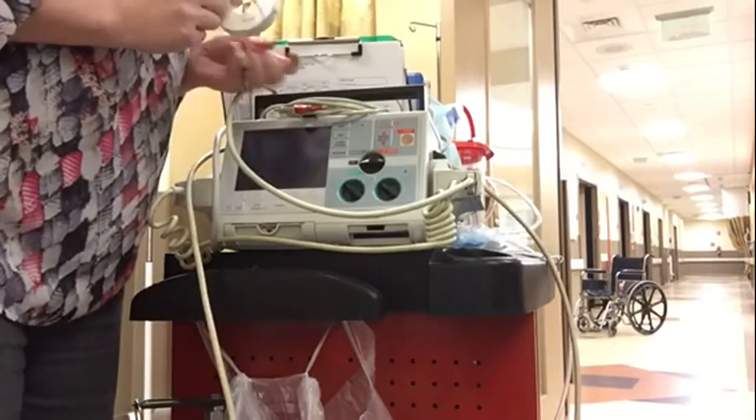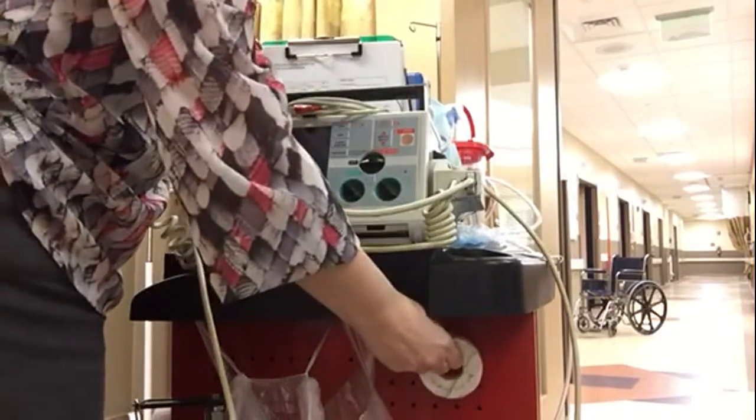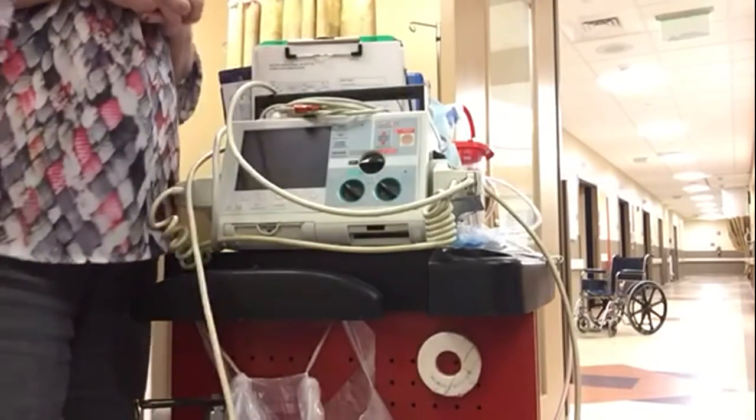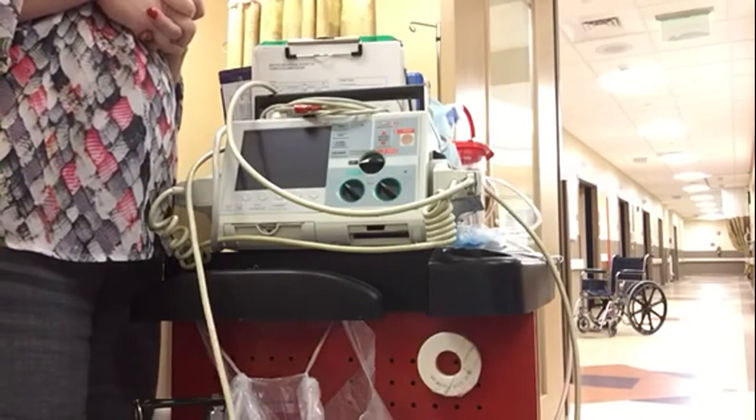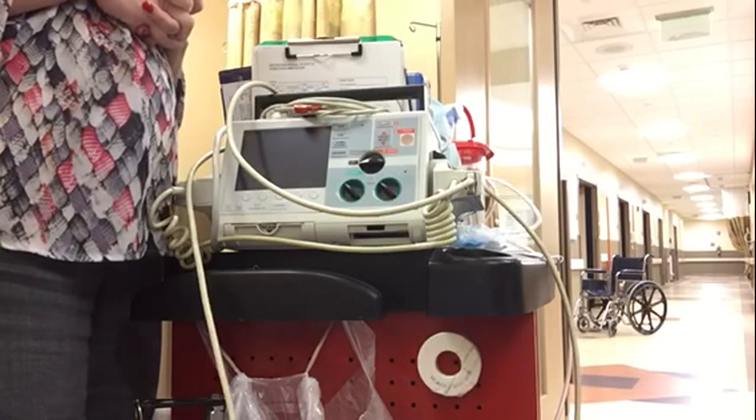You might also find a large magnet on the crash cart. If a patient has a pacemaker and it's not doing what it should be doing, they'll place the large magnet over the pacemaker to shut it off temporarily.